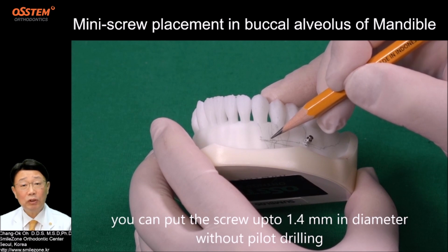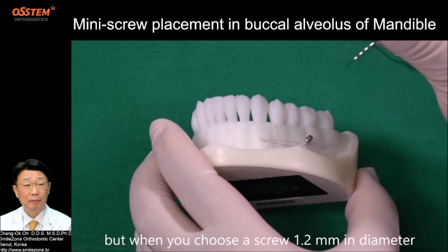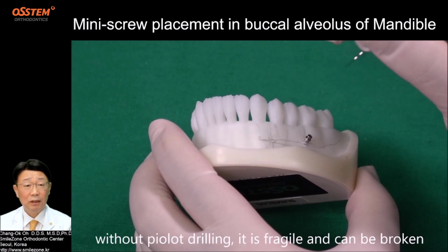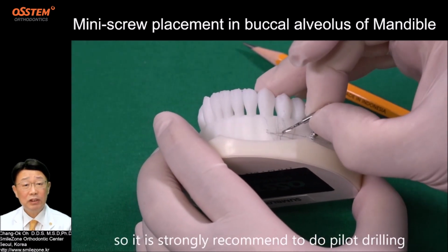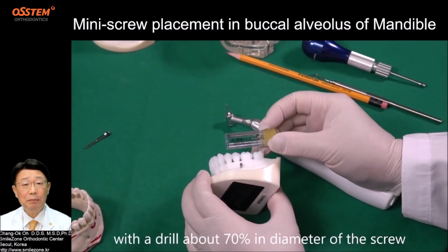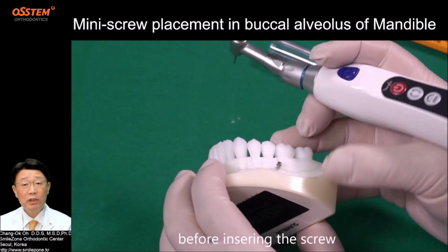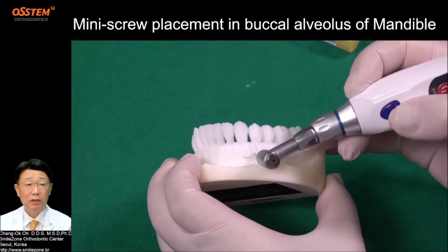You can put a screw up to 1.4 millimeter in diameter without pilot drilling. But when you choose a screw 1.2 millimeter in diameter, as the lower buccal cortical bone is more dense, without pilot drilling it is fragile and can be broken. So it is strongly recommended to do pilot drilling with a drill about 70% in diameter of the screw. That is a 1 millimeter drill for a 1.2 millimeter screw.